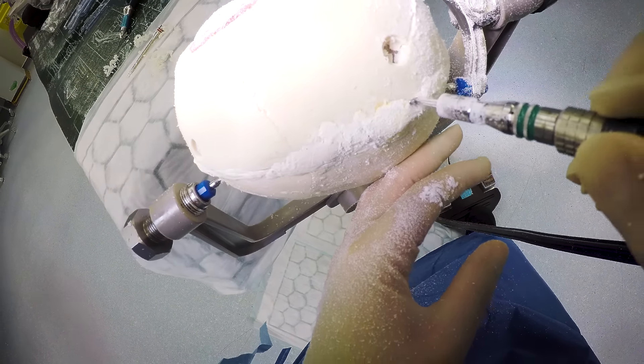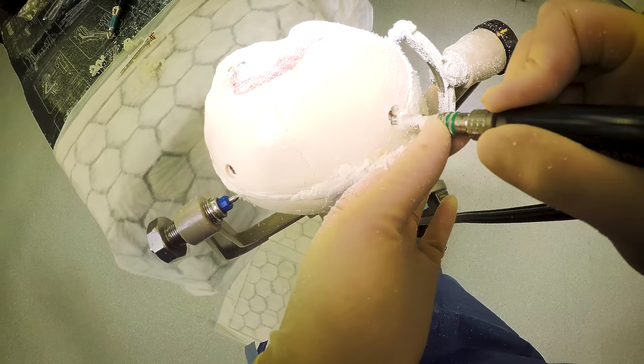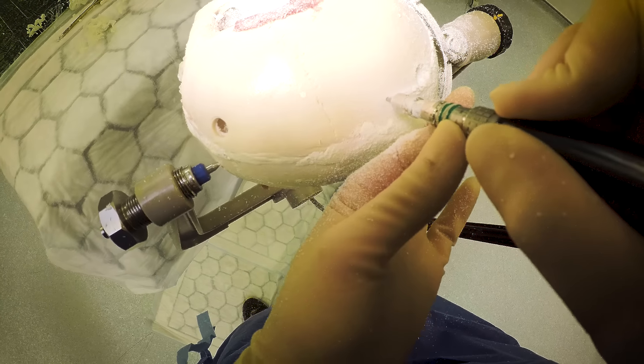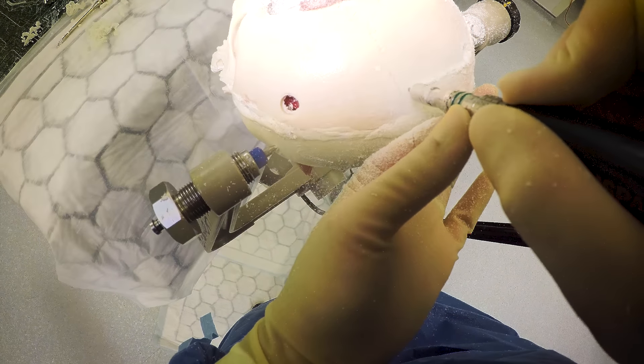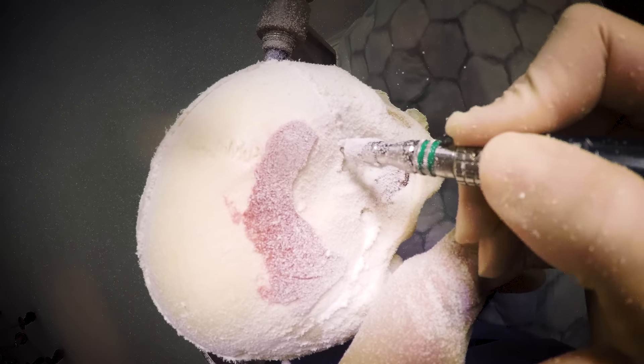When operating near the midline where there's the superior sagittal sinus — a big venous lake of blood — you want to be a couple of centimetres away, because damage to that sinus can be very difficult to repair and in some instances prove fatal. As you're coming round over contours, the craniotome can get a little stuck. It's important not to try to force things — just change your angle, give the blade a little wiggle, and it should move smoothly without too much force.